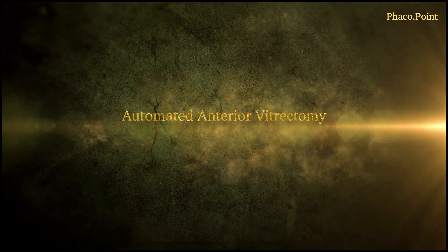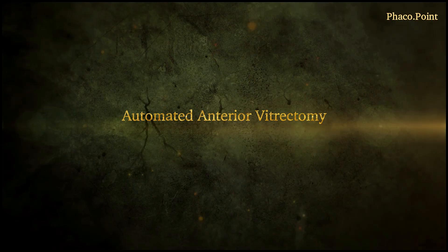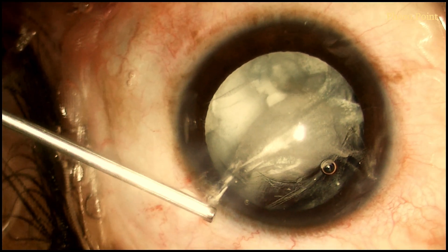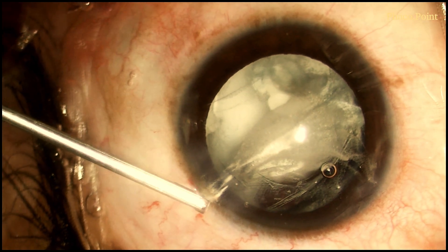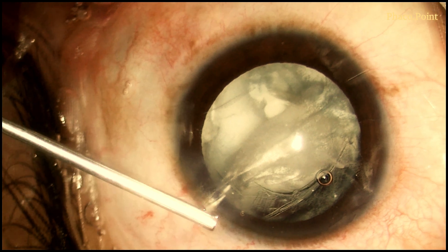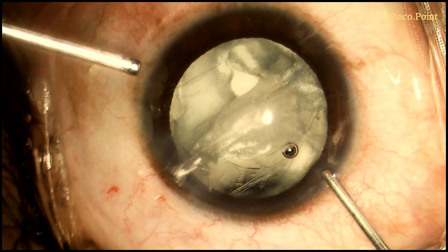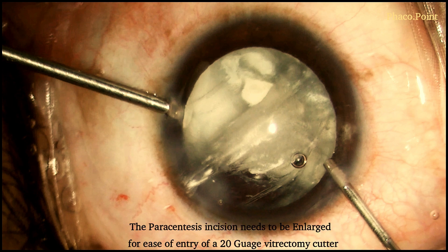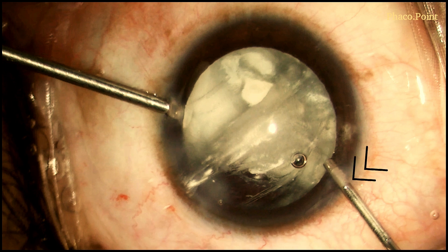We will now proceed to performing a limited anterior vitrectomy. In this particular case, I am using a 20 gauge cutter. We start with cutting the vitreous that has prolapsed out of the incisions. For the introduction of a 20 gauge cutter into the anterior chamber, the paracentesis incisions often need to be enlarged. The irrigation is first introduced from the opposite side prior to the introduction of the cutter.